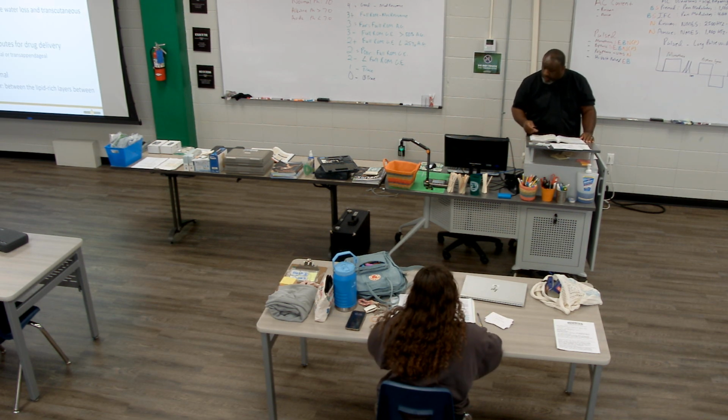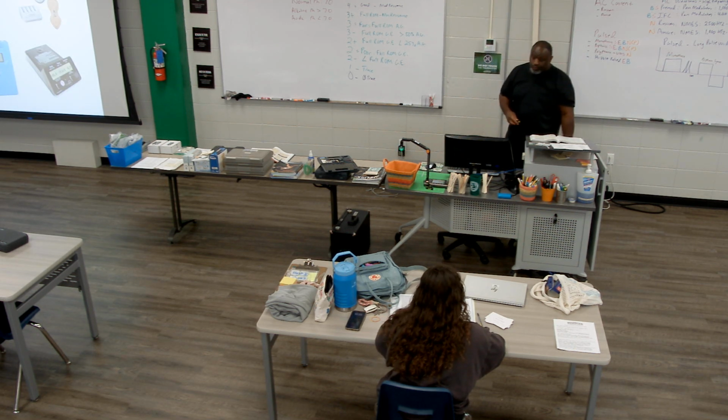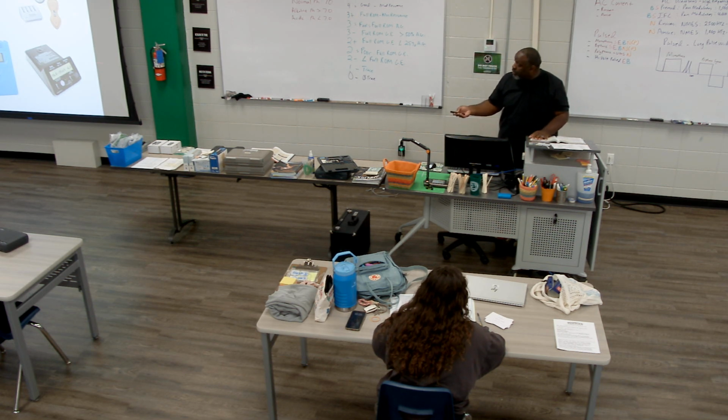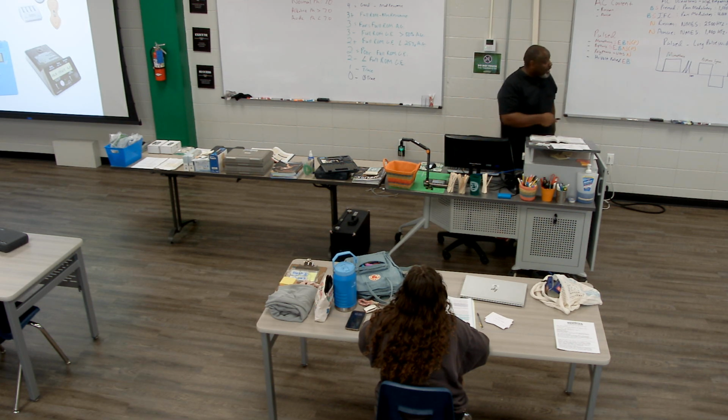So there are a number of different, let's show you these. There are a number of different devices that you can use to do iontophoresis. Some of these are a little bit older. So this is probably the oldest device I remember. It was made by a company called Empi, and it's always blue. So if you're looking for it and you see a blue device, that's iontophoresis.